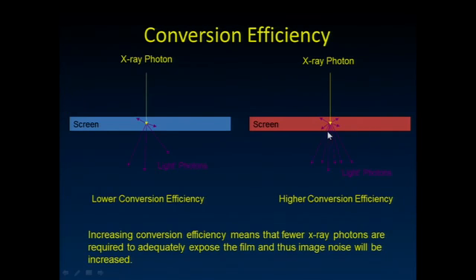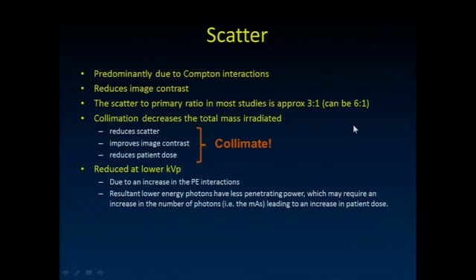Because each X-ray is going to generate more light. And so this increased conversion efficiency does result in a bit of increased noise in your imaging, because it's really the incident X-ray photons that determine how much noise was in the image, not how much light is produced. So that's the sacrifice that we play by using different materials to stop those X-rays.